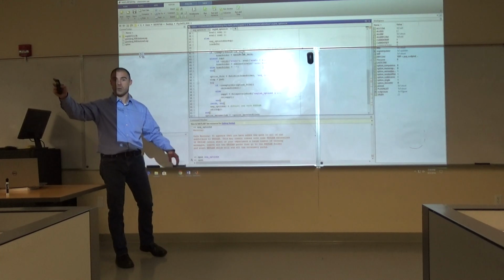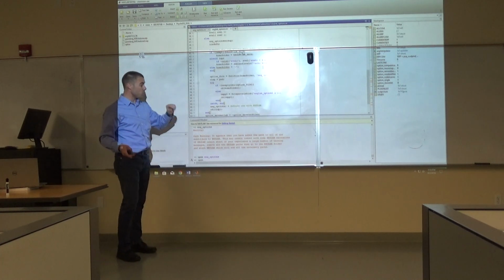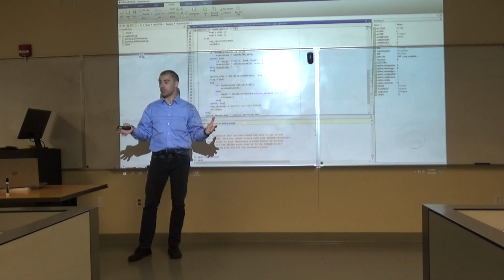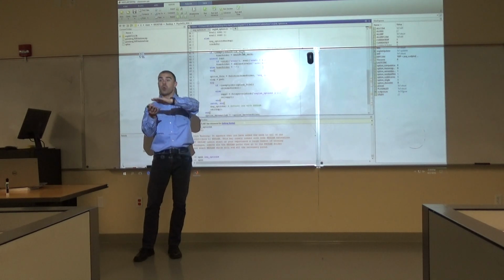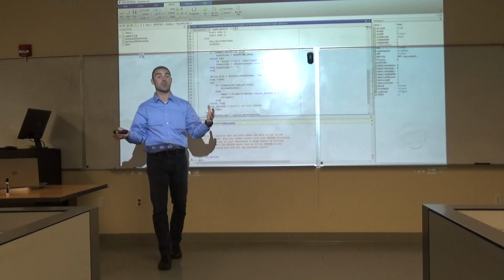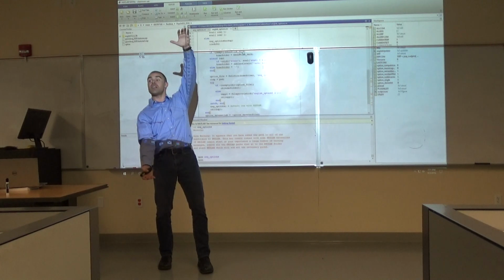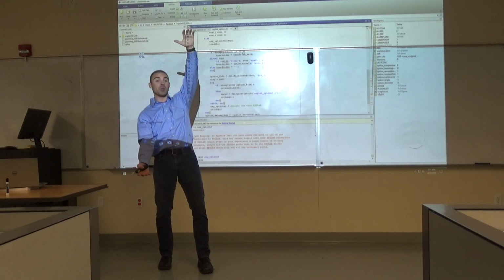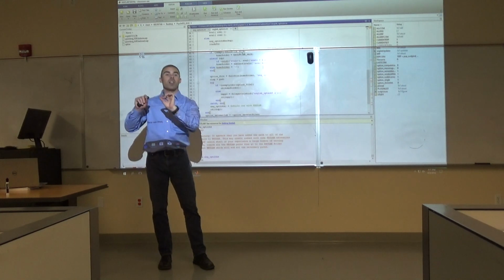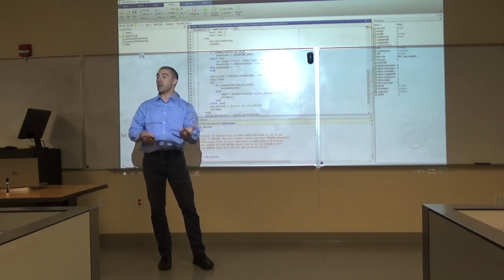Okay, so, gentlemen, what's your name? Jesse. Okay, so I was with Jesse, and I was able to see it on his computer and most of y'all's. What is great about Matlab, and a great way that you troubleshoot, is it'll tell you where the error is and in what file. Not just what file, because sometimes the files that the errors are in are thousands of lines of code long, and it looks like a bunch of gobbledygook. It tells you what line in the file the error is. So in this case, I believe it's line 45.